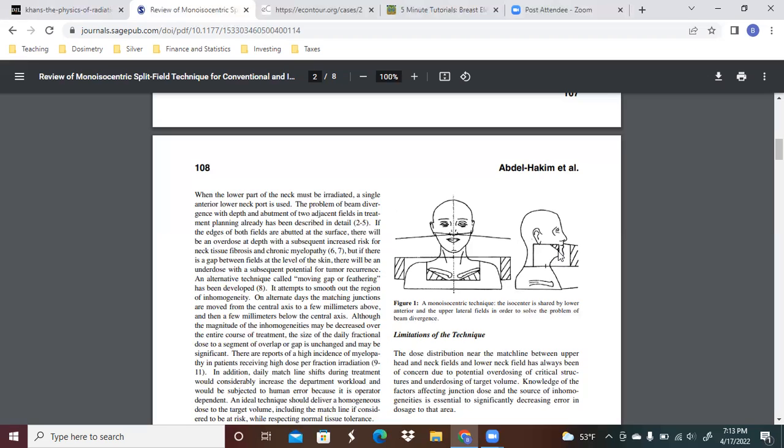So you're trying to spare the spinal cord at that particular point. And you take that up to a particular dose, whatever it is. Now, as you might imagine, you're wreaking all kinds of havoc through normal structures as you're using this particular technique.